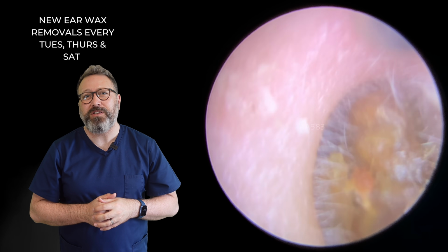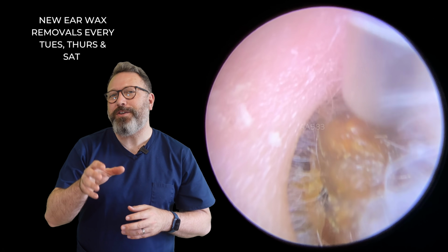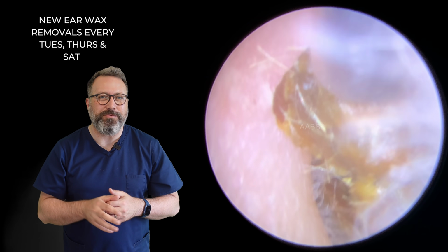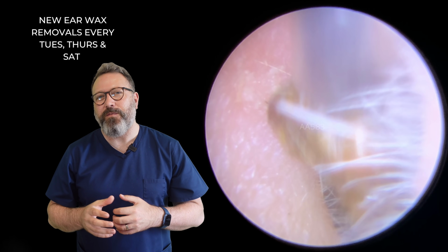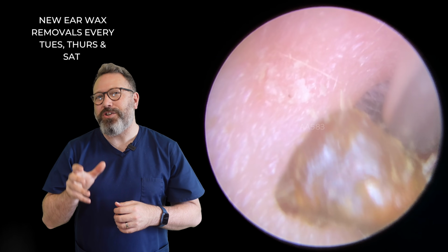You can see we've managed to bring this forwards. Now this was a really interesting case. Now this particular patient didn't really experience any hearing issues, but they did work in quite a noisy environment, so wanted their ears checked. But what they were experiencing was a little bit of tinnitus just on this one side.